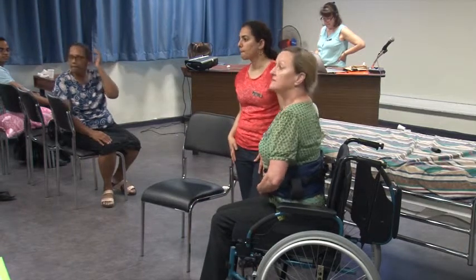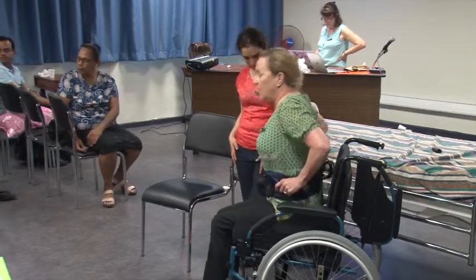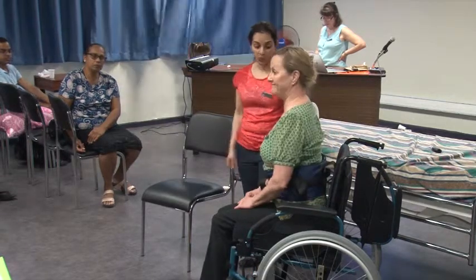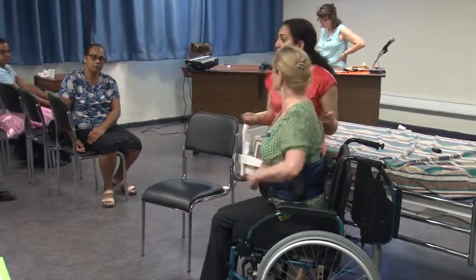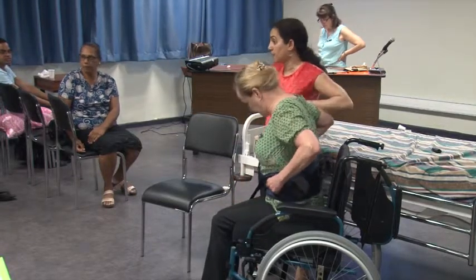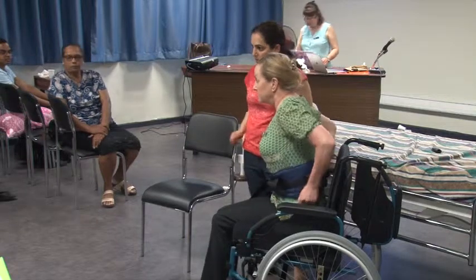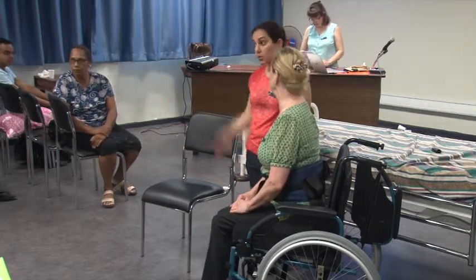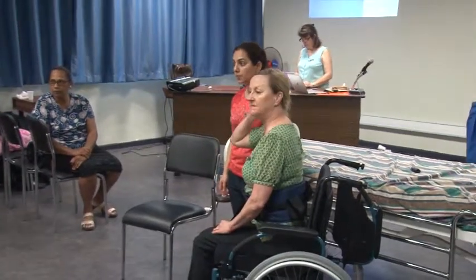What I wanted to say is where we place it at the waist. Oh yeah, the waist. And if it is sliding up, that means it's too loose, right? It should not be sliding. It should not be coming up here. It's too loose. You need to have it nice and snug. Yes, this is what happens from here. So it's too loose.